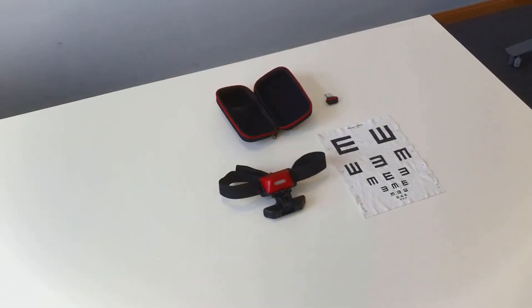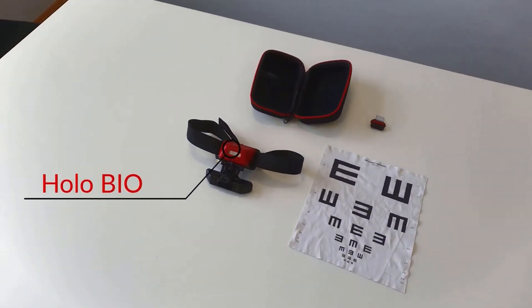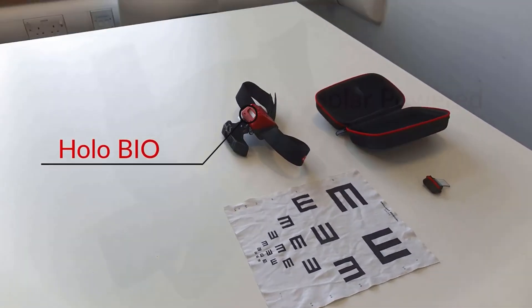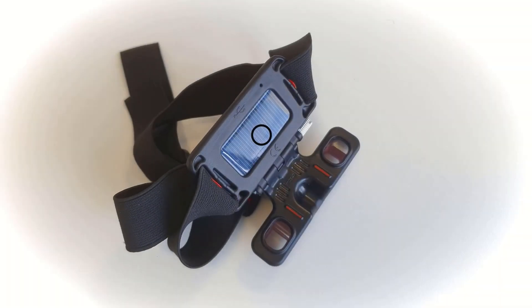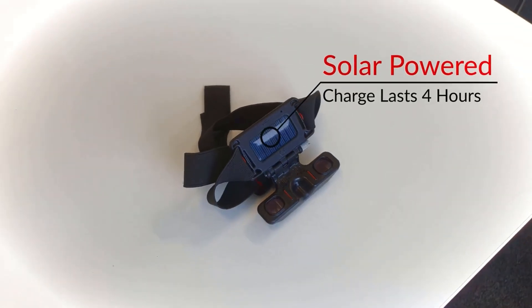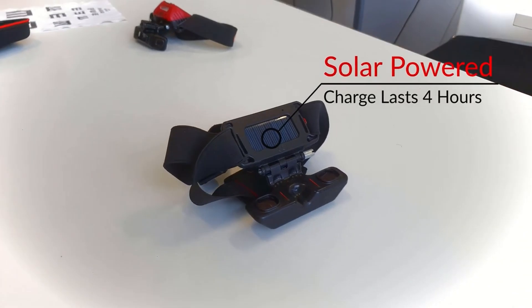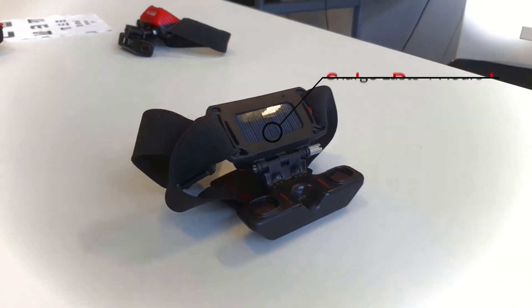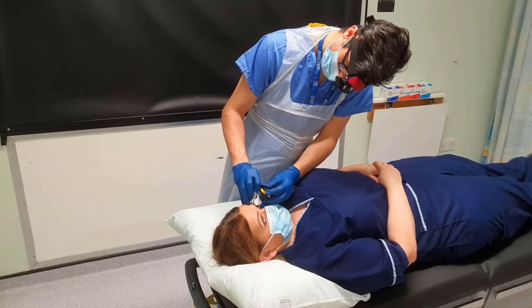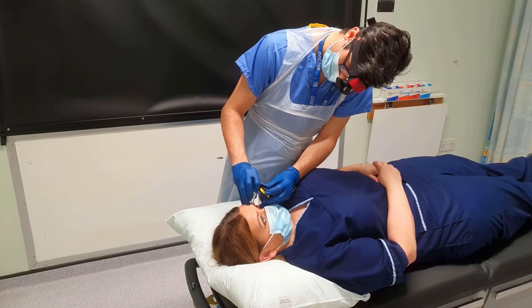It is also mobile and easy to carry around. It can therefore be used to examine patients with poor mobility, such as patients who are wheelchair bound or bed bound. For less co-operative patients such as babies and young children, you can usually still get a good idea of whether the back of the eye is healthy or not with a brief view.